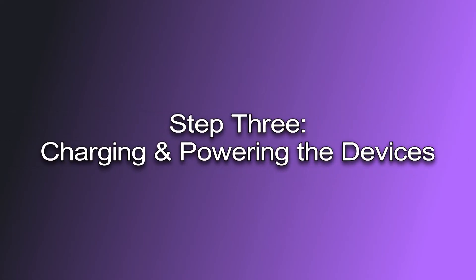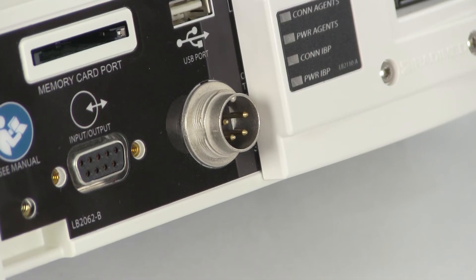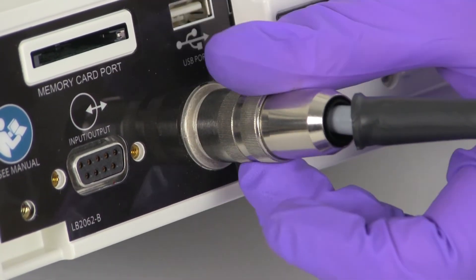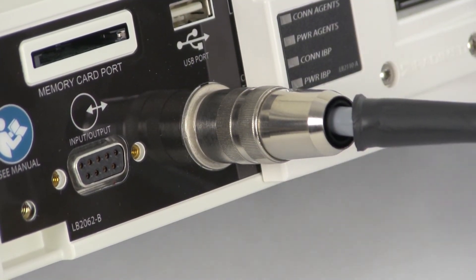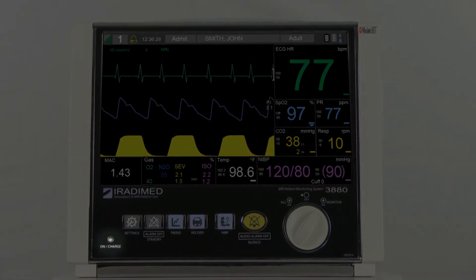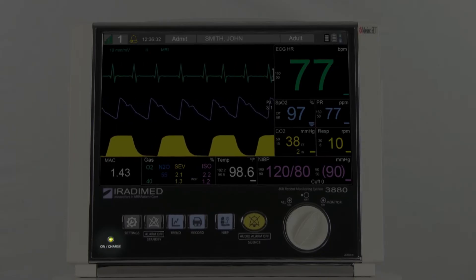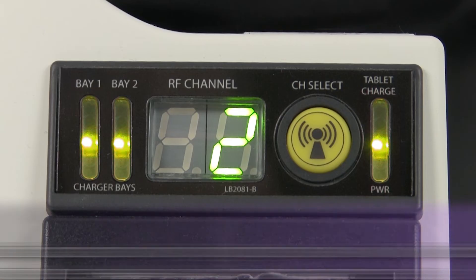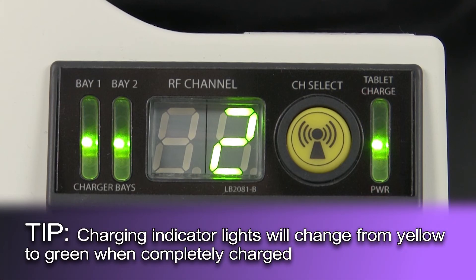Step 3: Charging and powering the devices. On the back of the monitor there is a circular power port. The user will take the power cable and attach it to the power port and secure it by rotating the adapter clockwise. The user will then plug the power cord into the outlet. On the front side of the device, the on-charge light will illuminate showing the device is receiving power. The battery will be fully charged within several hours of first use. Each 3880 monitoring system and wireless remote tablet includes batteries that last up to eight hours when fully charged. If you are operating the system on battery power, ensure you insert a fully charged battery into the device before turning it on.